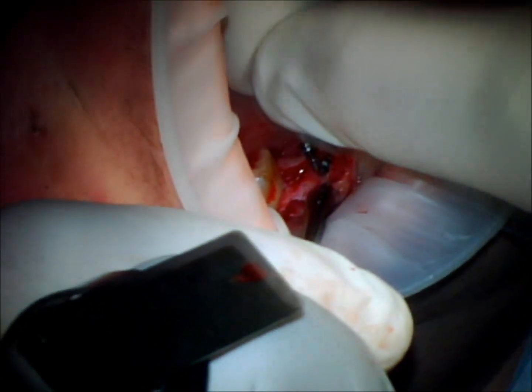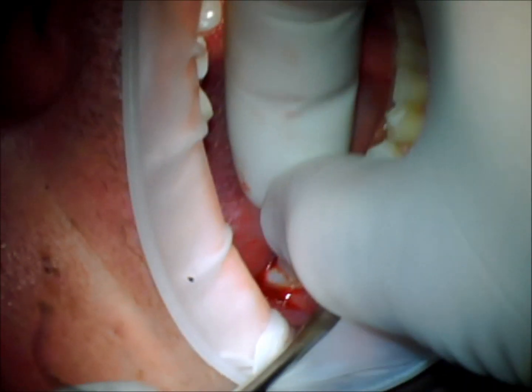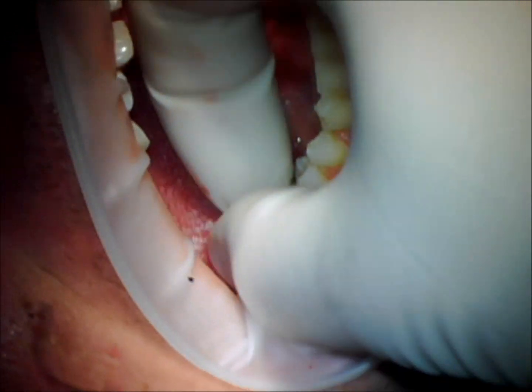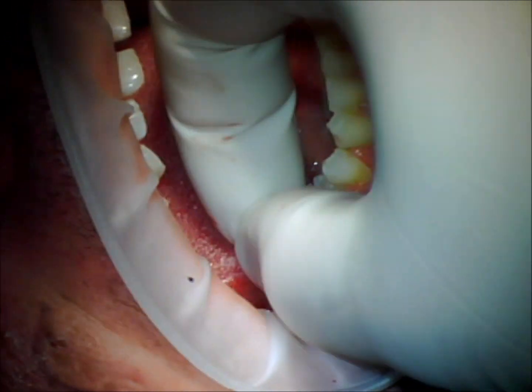And so this is the cover screw going on. I'll just put these on finger tight.